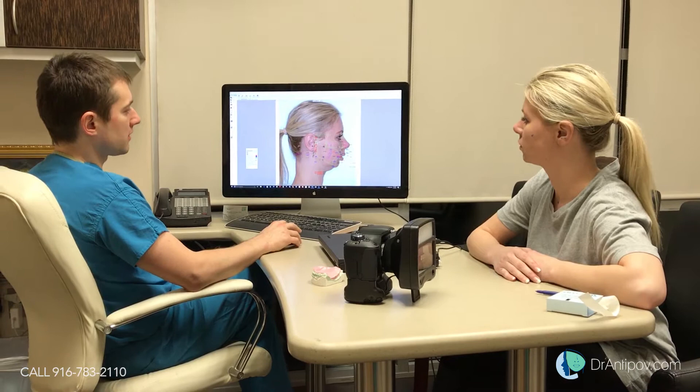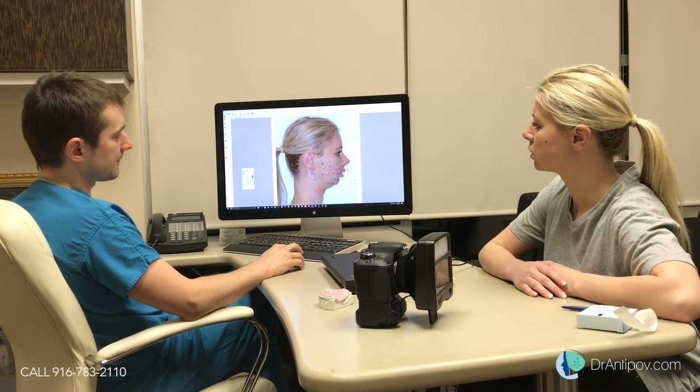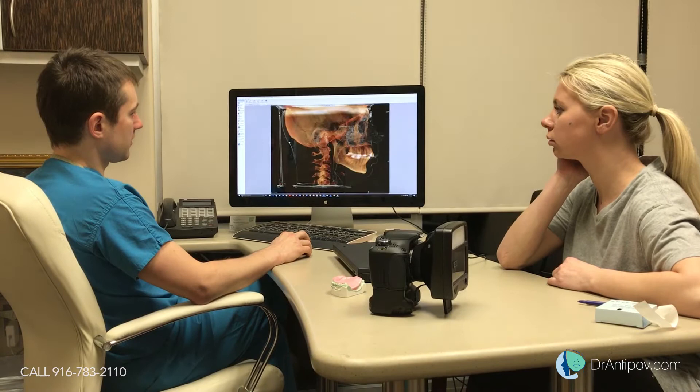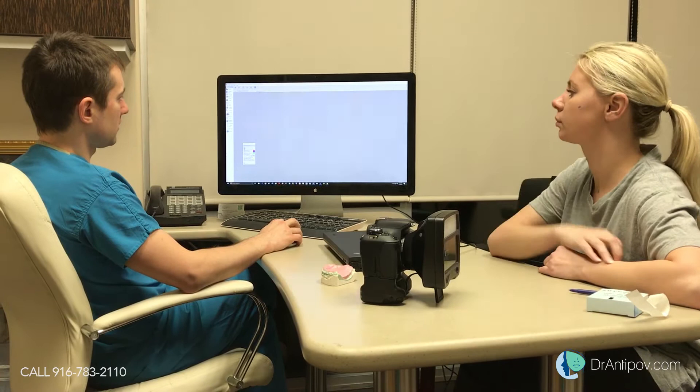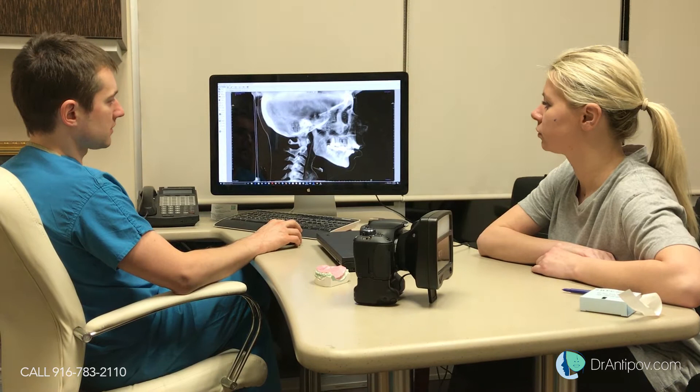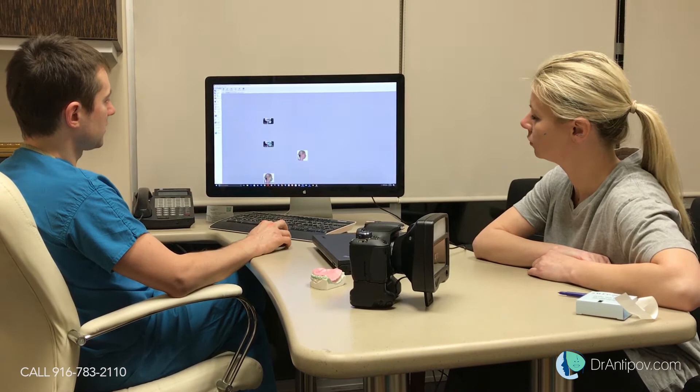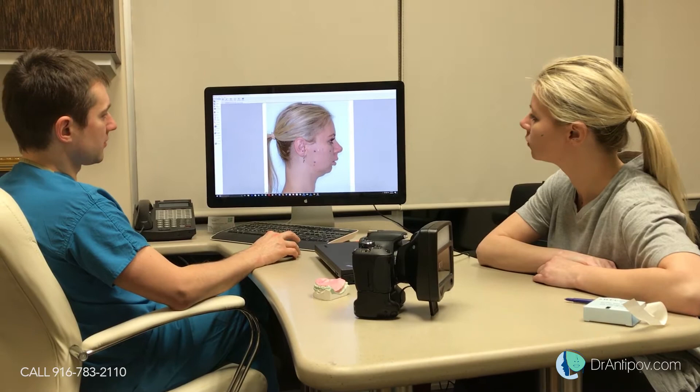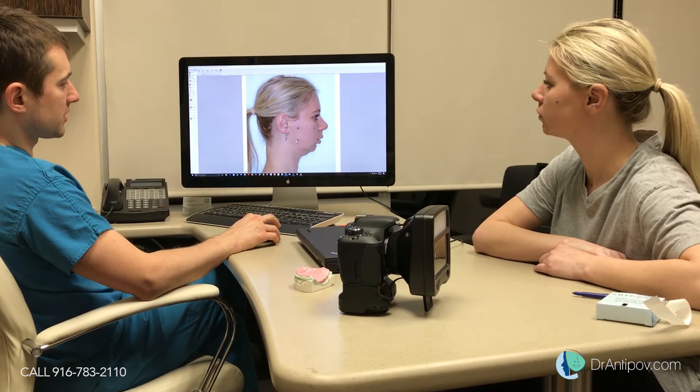We did a natural head position profile picture for a patient and we did all the tracings. We took the 3D imaging scan and did the tracing - you can see the airway, the soft tissue profile, the splint. Then we applied the facial picture with the facial markers, and those dots represent the natural head position, which is vertical and horizontal.